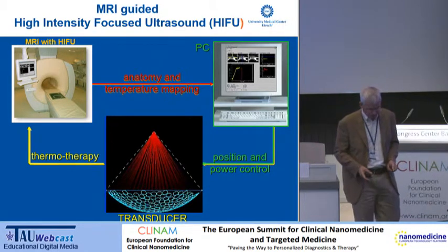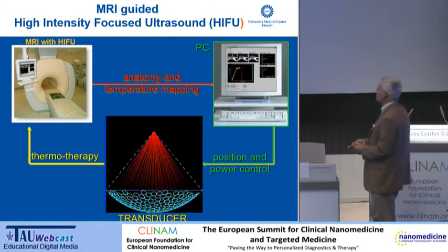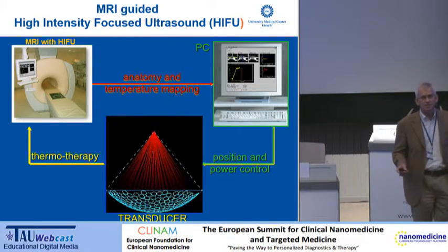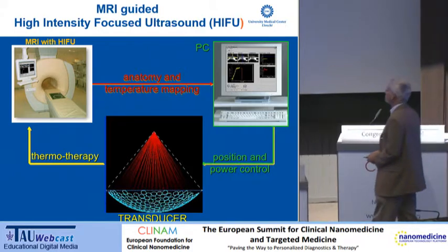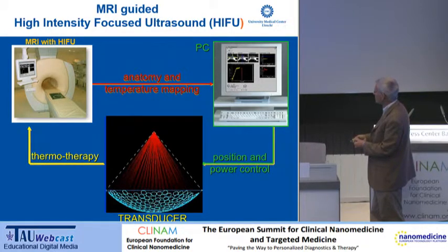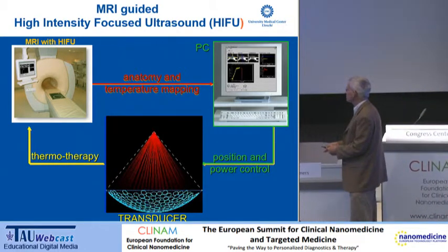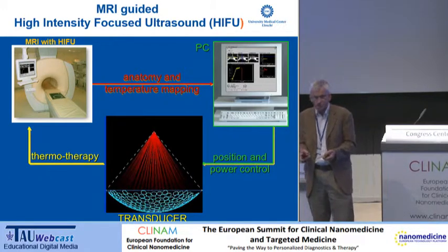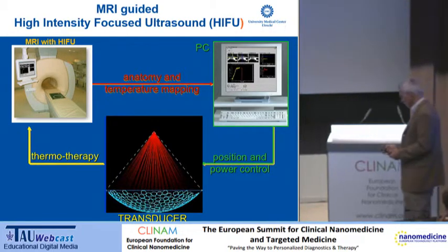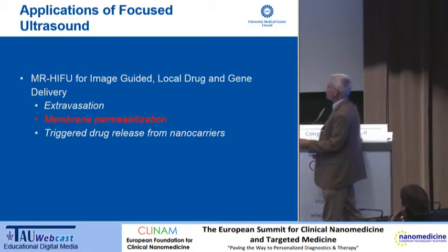Now, the MRI, of course, you know it. The MRI is used for providing a lot of anatomical detail and providing the target. Where do I want to focus? Once you have that, it's an interesting feature that MRI is the only method that can reliably give you temperature maps of temperature changes during your intervention. So first you use this for targeting, and then you use it for adapting the energy, because since you can measure the temperature inside the tissue, in the focal point, you can adapt the total energy and reach a hyperthermia or even a very high temperature if you want, in a controlled way: this MR-guided HIFU.